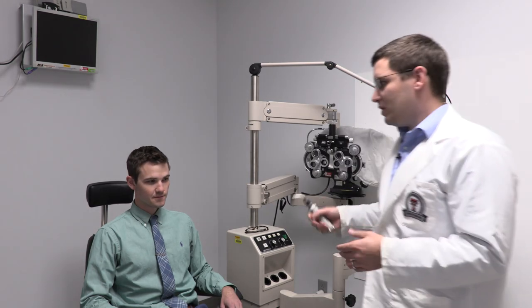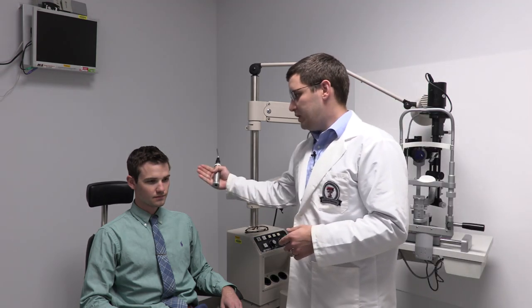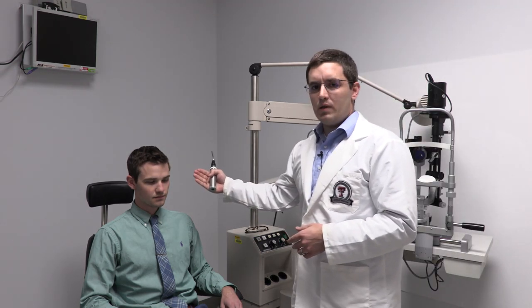First, you want to position the patient so that they are comfortable and so that you have easy access to the temporal side of the eye being examined while being able to see directly into the eye. Next, turn your pen light on and examine the eye from the temporal side. You do not want to be too far behind the eye or too far forward, as this will give an inaccurate result. You want to try to be in the same plane as the iris.